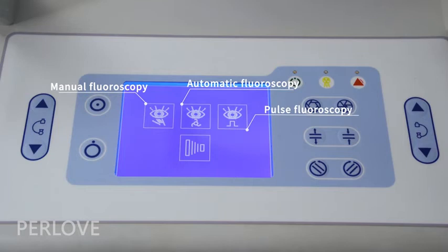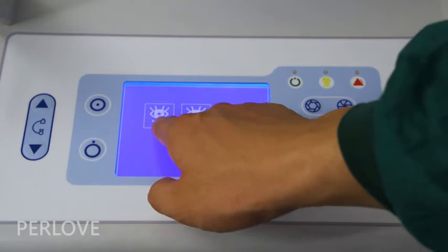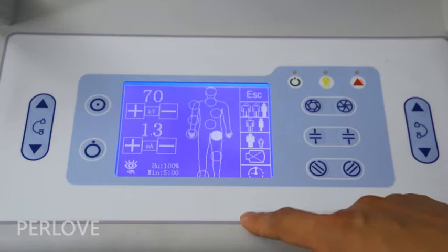The control panel has 4 modes for operation: manual fluoroscopy, automatic fluoroscopy, pause fluoroscopy, and radiography. It features a human body graphic LCD touch panel, which can help doctors quickly set APR parameters.